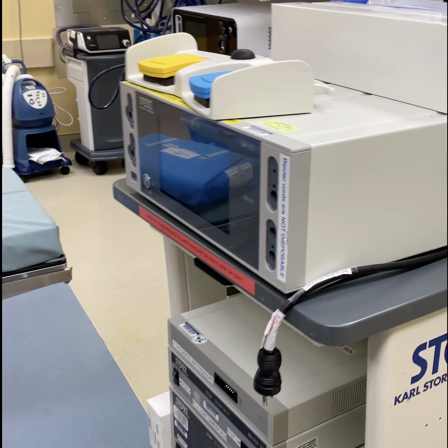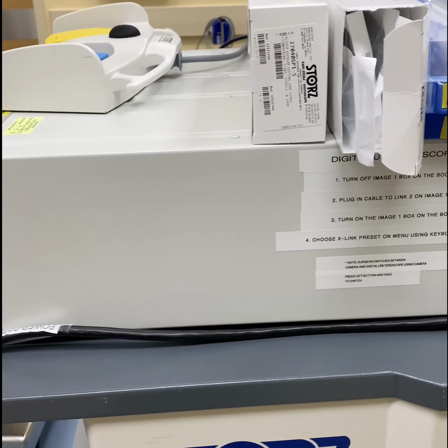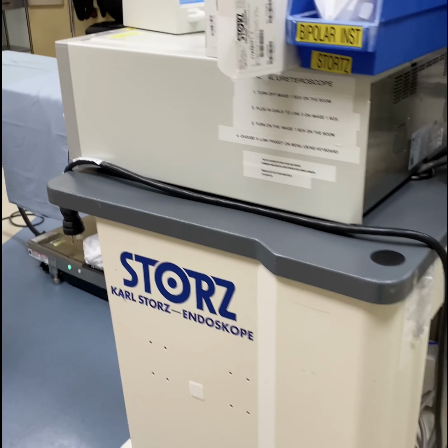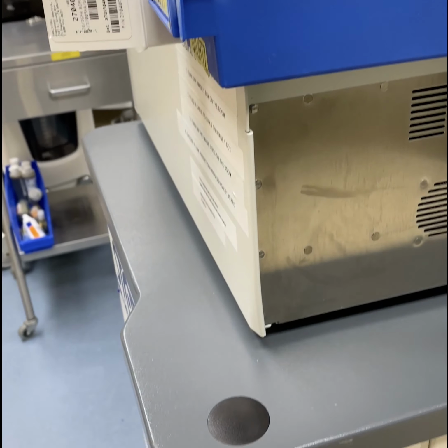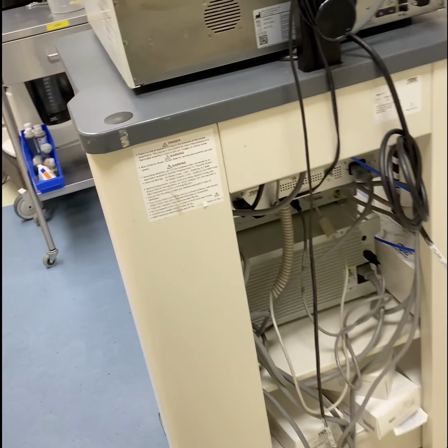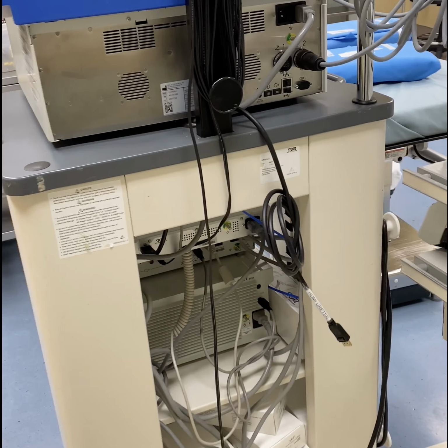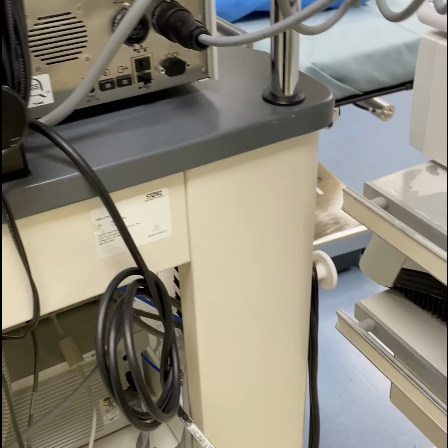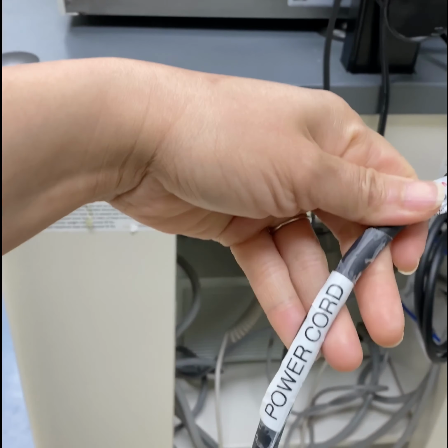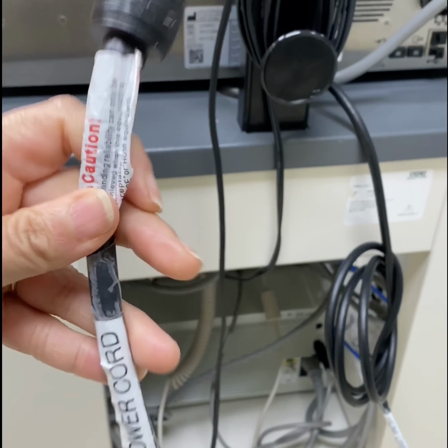So once you have all your equipment in the room, it's time to start setting this up. Just so you know, when you bring in your blue light cart, you do not plug it in immediately. There's certain steps that you have to go through prior to plugging it in. I did label the power cord. This is the main power cord. Do not plug it in.